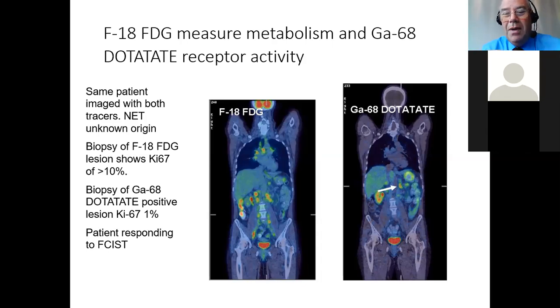Okay, but do remember that not every lesion is going to be positive on dotatate, and particularly those that have a high Ki-67 may not be positive. So this is a patient who was a professor of pathology, so she was very interested in what was found. This patient had 2 scans done.